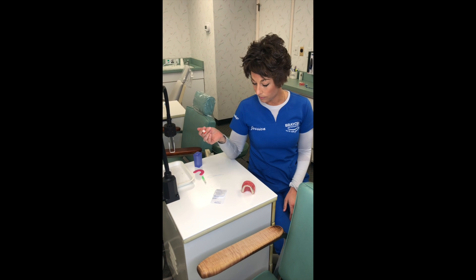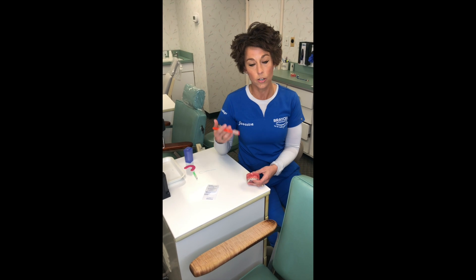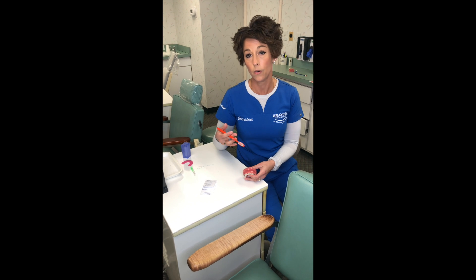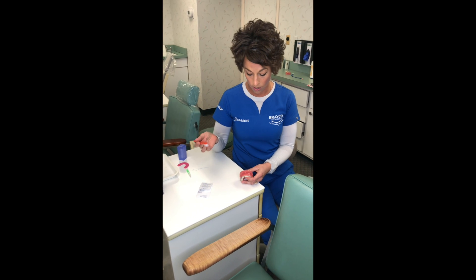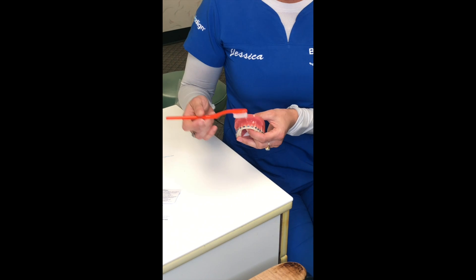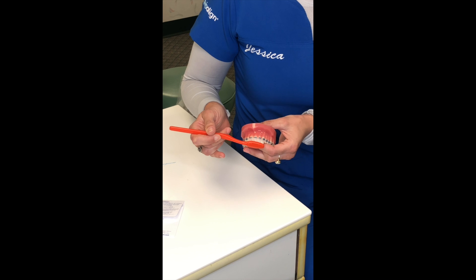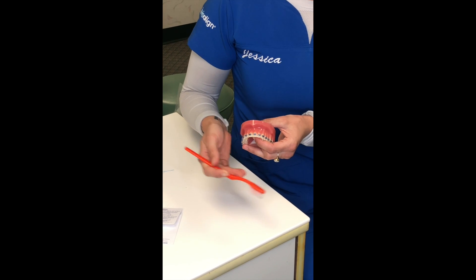Welcome to braces brushing 101. When you get your braces on, it's really important that you start brushing your teeth three times a day. When you brush, it's important that you're not just going straight across your teeth, but that you're angling your toothbrush so you get on top of the brackets and also angle it so you get up under the brackets. Same thing for the lower teeth.